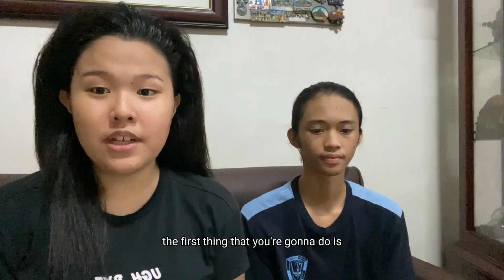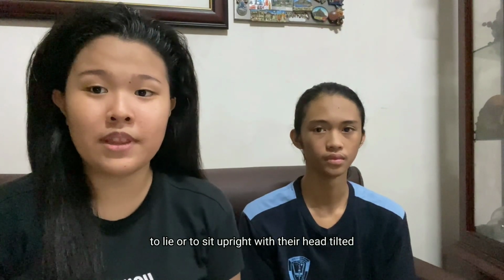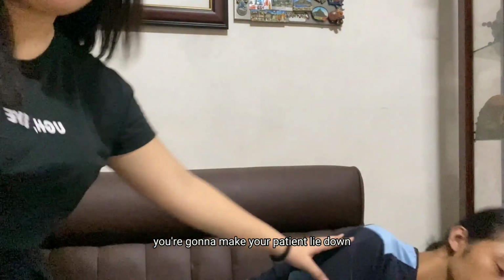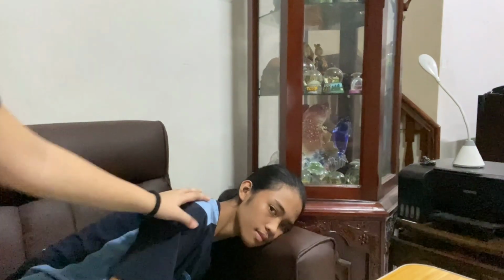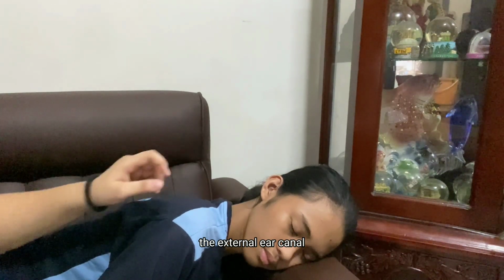The first thing you're going to do is instruct the patient to lie or sit upright with their head tilted towards the unaffected side. So you're going to make your patient lie down like that, towards the unaffected side. The next thing you're going to do is straighten the external ear canal.